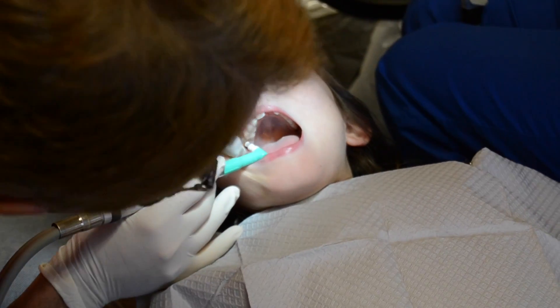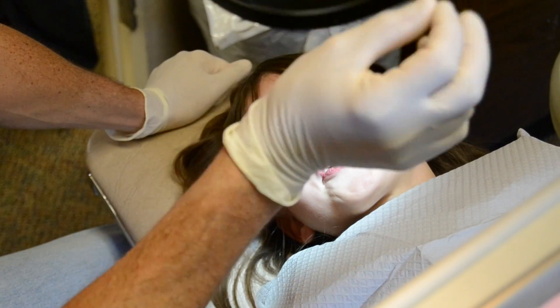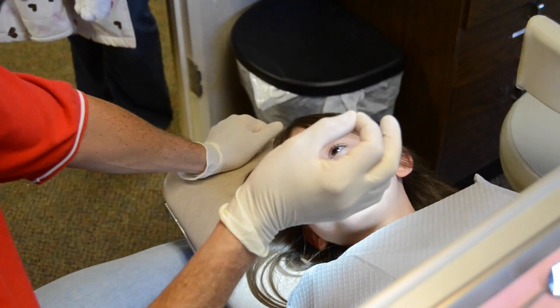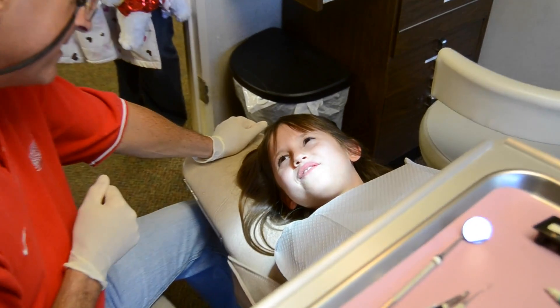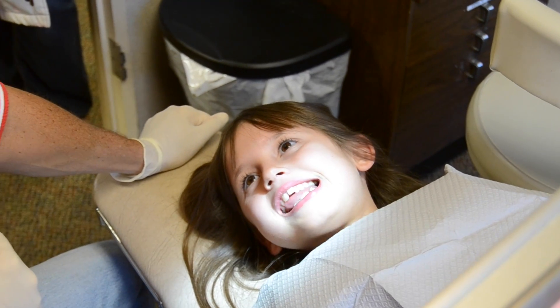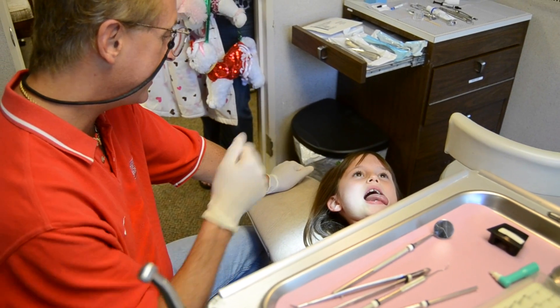So you've got to open really big. I won't put in the tooth pillow if we don't need it. I've got to put stuff that makes the tooth frosty, then we rinse it off, we put the sealant on, and then we zap it with the light to make it hard. It's real easy. What does the light feel like? It doesn't feel like anything — it's just the light that makes the stuff hard. It's like soft, it goes in there like honey, and then you put the light on and it makes it hard.